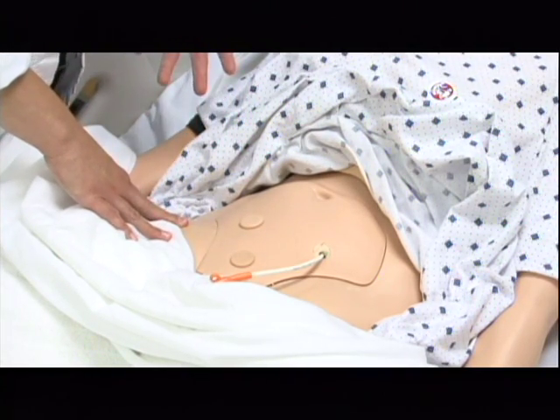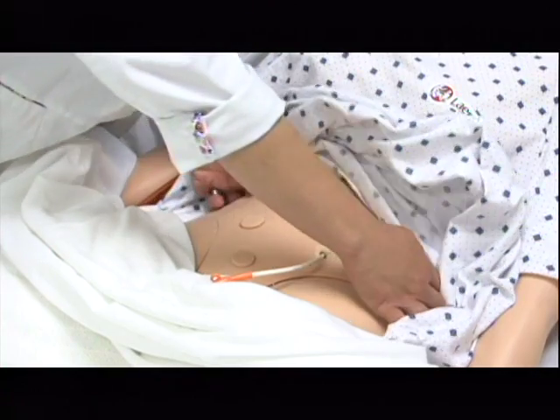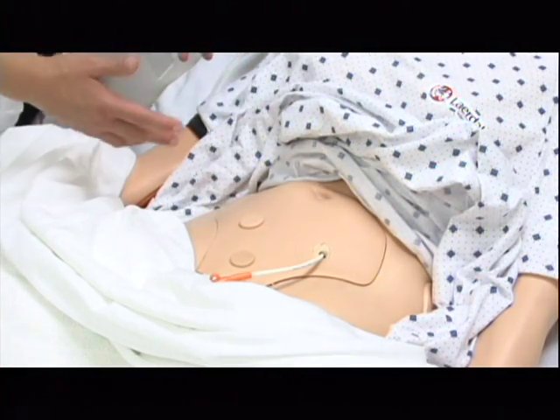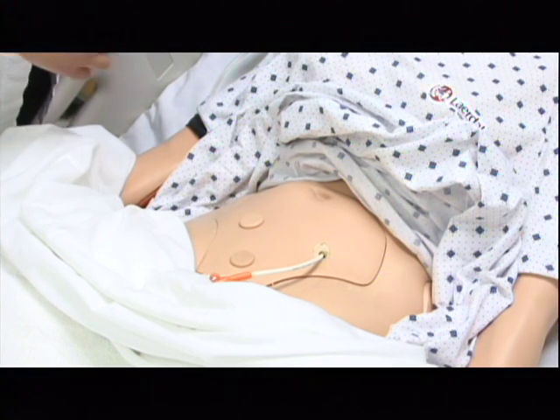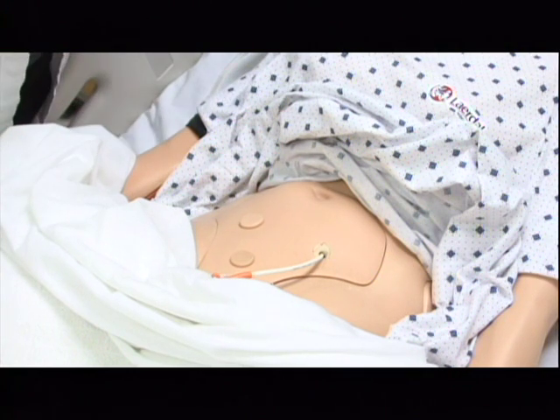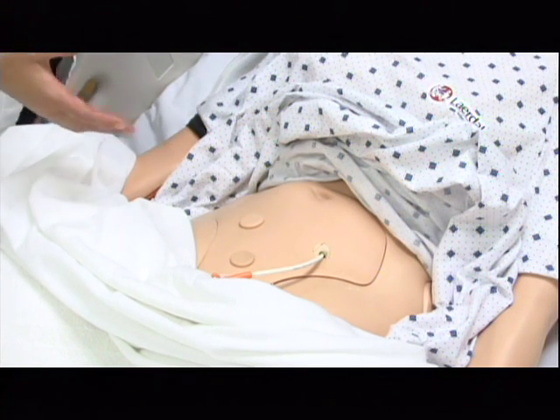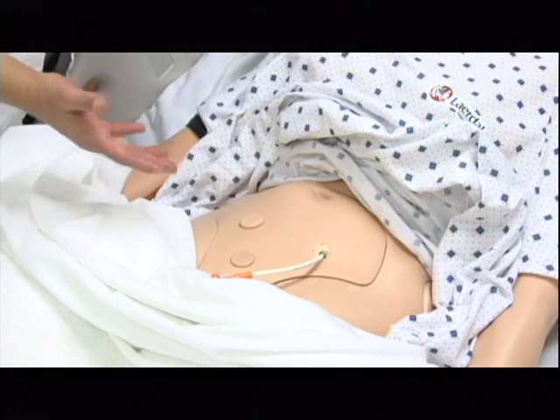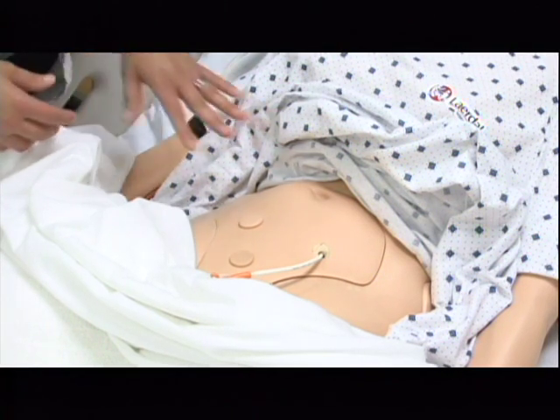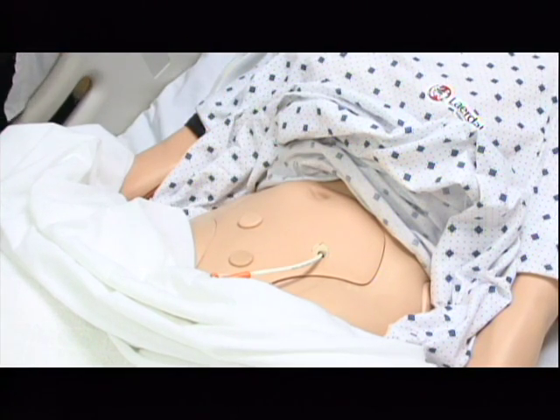If I needed to measure her at this point, I could use the tape measure and measure around her waist all the way around at the level of the umbilicus, looking for abdominal circumference. Make sure you review your facility policy. Another assessment that could be made would be weighing of the patient, and based on facility policy, you may weigh them daily, you may weigh them once a week. Certainly always weigh them at the same time, and your patient should have a nutrition consult because this patient will be receiving tube feeding, so we want to keep an eye on her and see how she's doing with that. The next thing I would need to do is confirm placement.